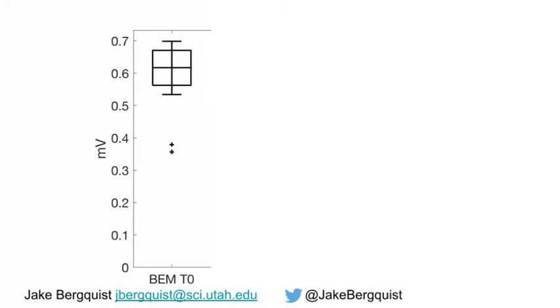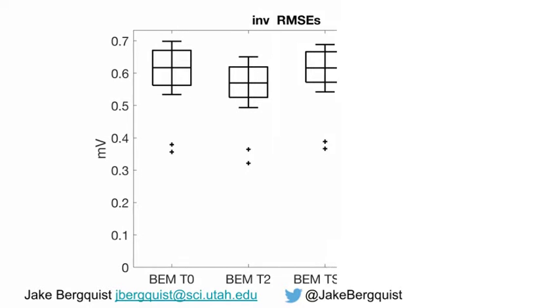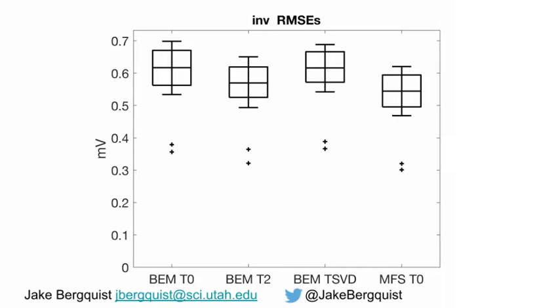We'll see on this graph boundary element method Tikhonov zero order, Tikhonov second order, TSVD, and then MFS Tikhonov zero order appear from left to right. These box plots represent all 80 beats spread across the two pacing locations. As we can see, each of the inverse methods performs similarly.